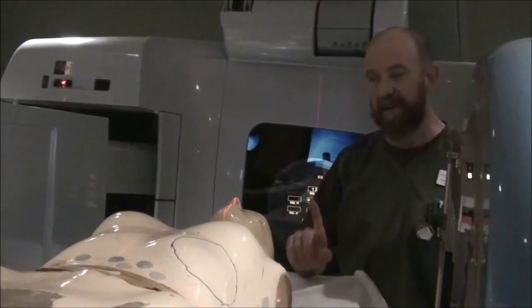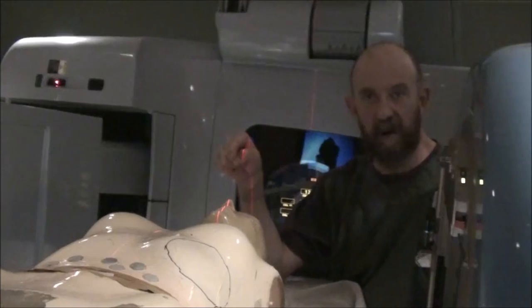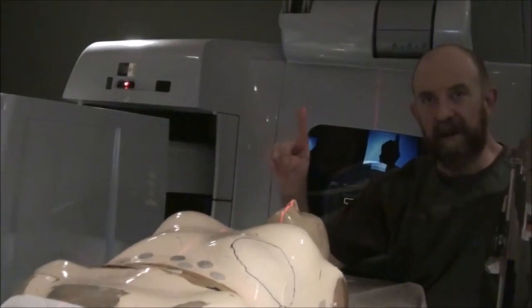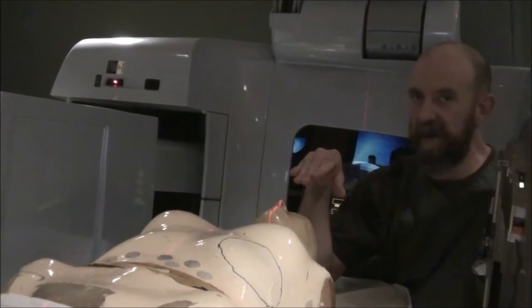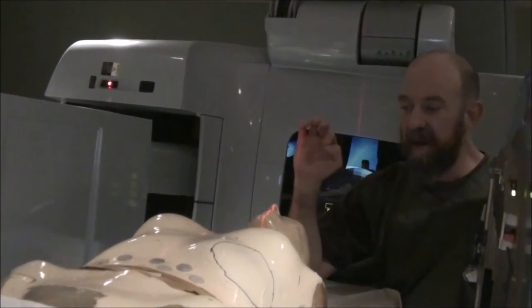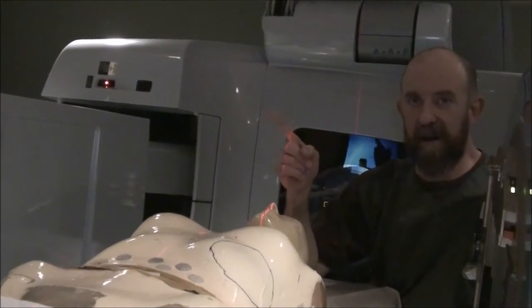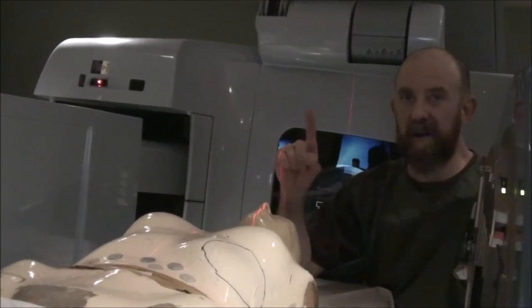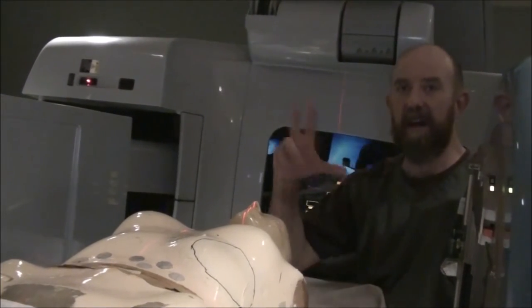Now that she's ballparked, you're going to go out of the room and fluoro. When you fluoro, you're going to be able to see the flash and the anterior portion of the vertebral bodies. Depending on your facility and your physician, you're either going to go to the top of those vertebral bodies or split them. Once you like it, call the doctor. The doctor comes in, looks at it, loves it. Once the doctor loves it, you notate the collimator angle, the gantry angle, the table settings, and the field size.